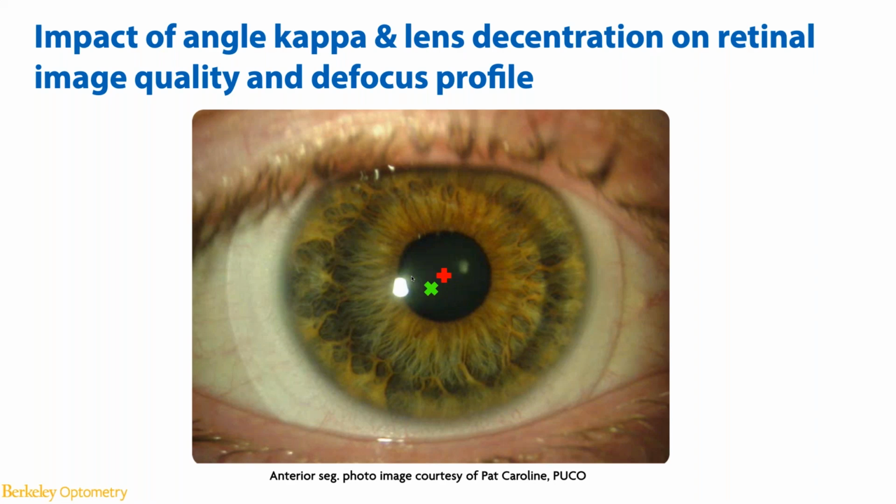So here you can see, because the direction of the pupil center or the line of sight is usually the opposite direction to soft lens decentration, soft lenses are more commonly decentered out and down due to the asymmetric scleral elevation, versus the line of sight is more commonly offset in the superior nasal direction. And if this is a single vision lens, usually it has less impact on the optical quality or the visual quality of the patient.